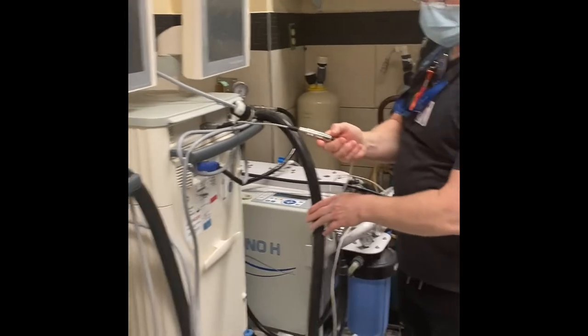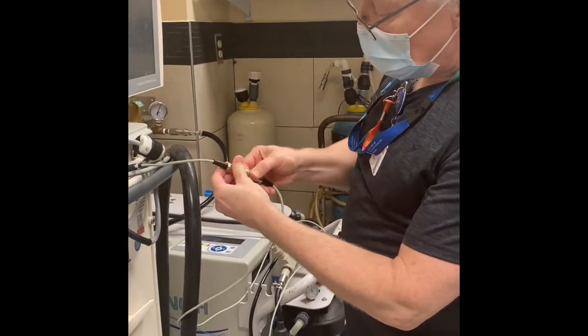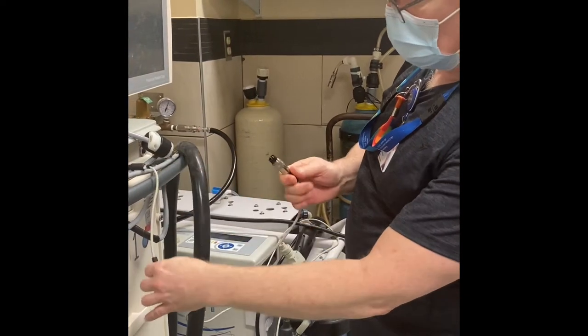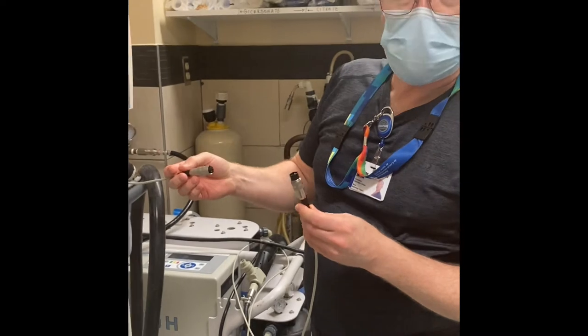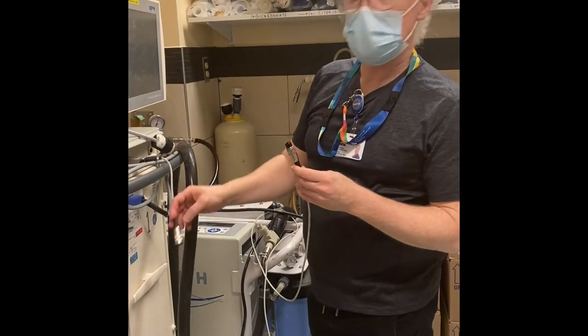Disconnect the interlink. You have to unscrew the collar counterclockwise and unplug. Be very careful — this cable is sensitive and easily broken, so please don't be rough with it. Don't be aggressive with it.